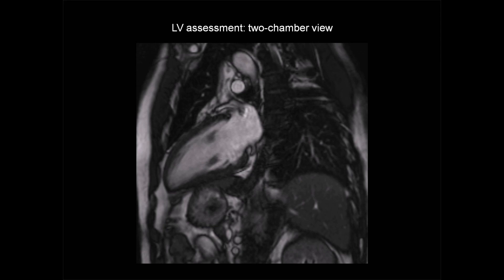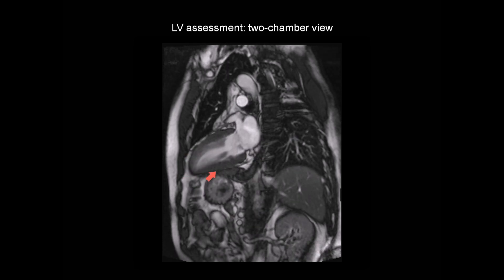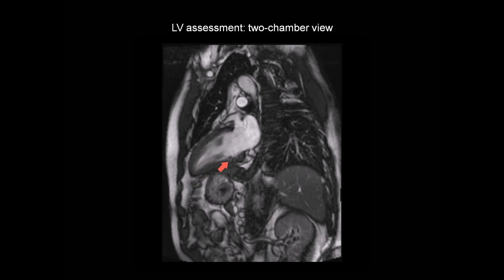Moving on to the two-chamber view, we have the left ventricle, mitral valve and left atrium, with basal, mid and apical segments. We have the basal anterior, mid-anterior and apical anterior segments, and the basal inferior, mid-inferior and apical inferior segments — so the anterior wall and the inferior wall seen in the two-chamber view. The cine CMR image allows us to assess systolic function, and wall motion and myocardial thickening are normal in this image.